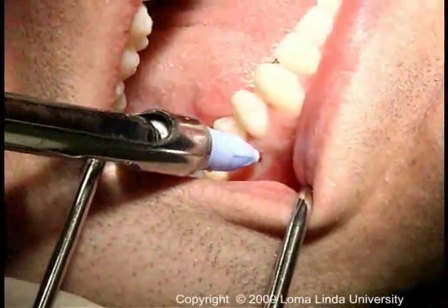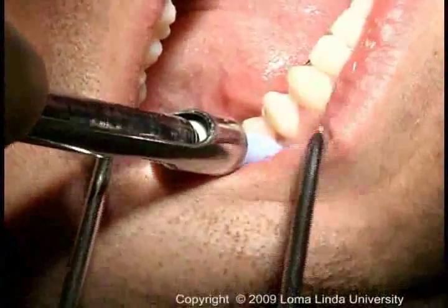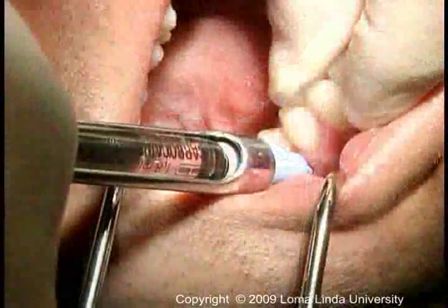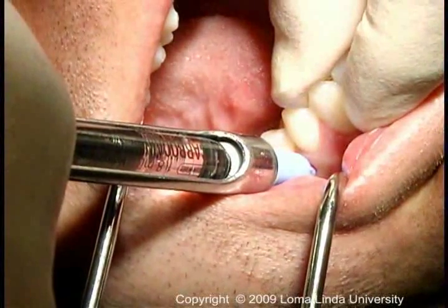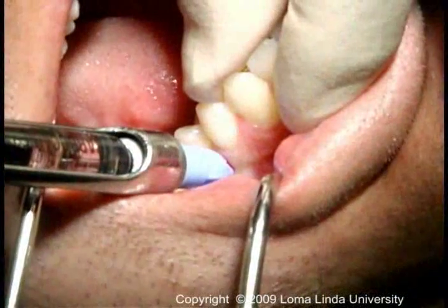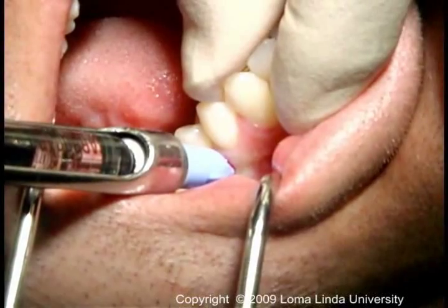Place the needle to its hub against the tissues to minimize leakage of anesthetic into the oral cavity. Approximately a half cartridge is injected under some back pressure. Note the blanching of the mucosa.